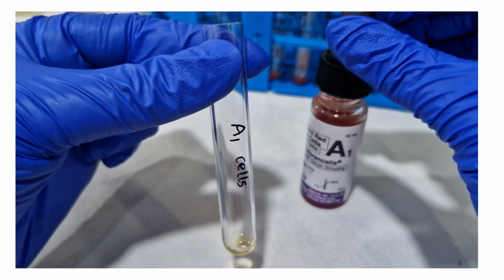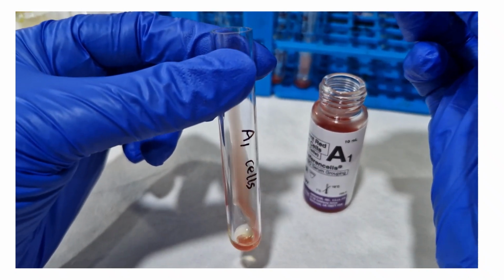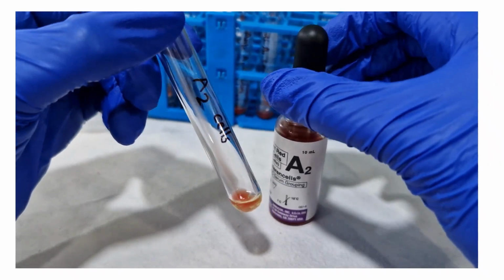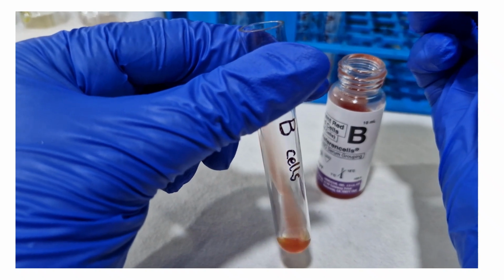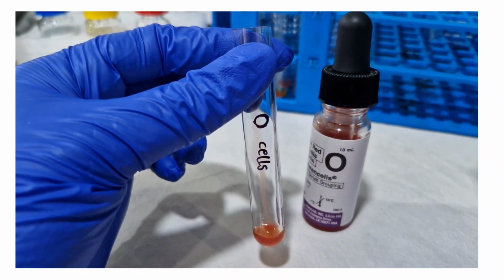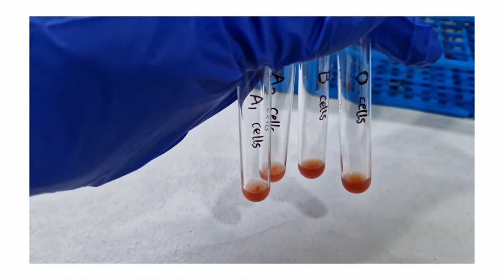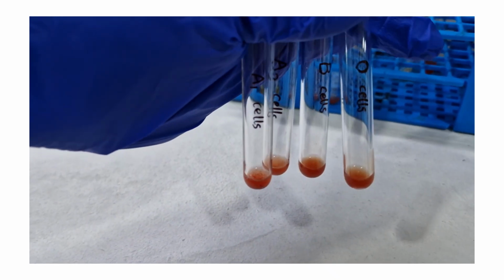For reverse grouping, we have commercially available A1 cells, A2 cells, B cells, and O cells, and we will add 1 drop of each to the respective tubes. Gently shake the tubes of forward and reverse grouping to mix the contents thoroughly.